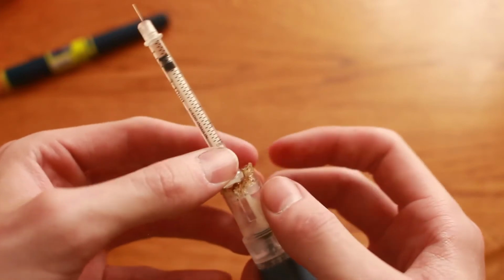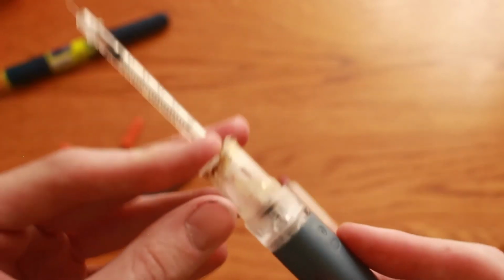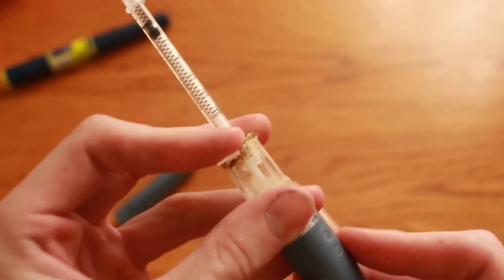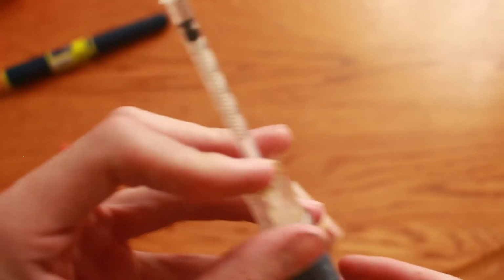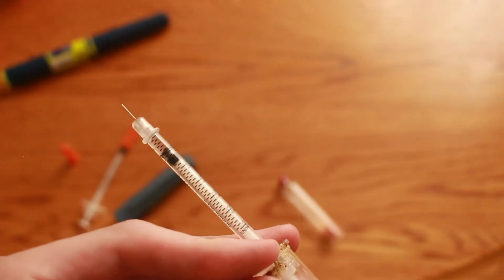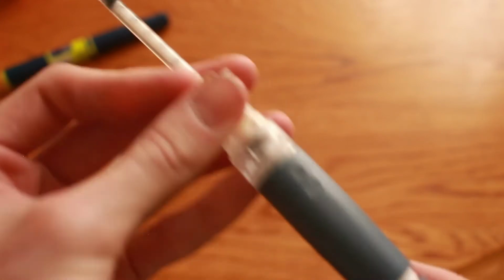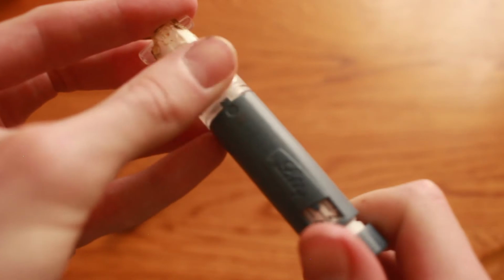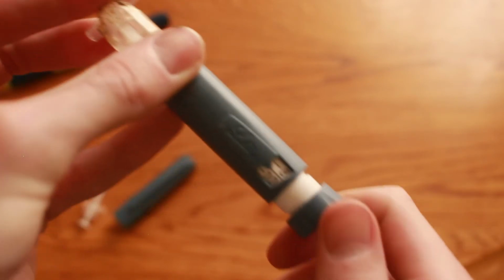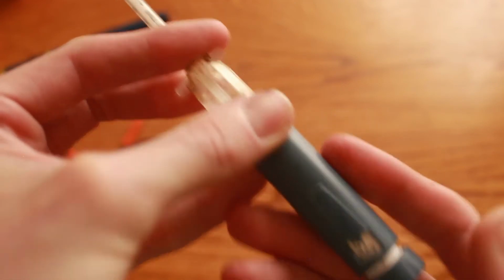Now let me give you just a demonstration of what I'm talking about if I can. Normally I have the cap on so that it stays level, so it's not going to look quite as stable here. But let's say right now we are at just about 4-ish units, right? Let's take it down a unit. Let's see what it looks like. We could bring that to 10. We hit it, boom.